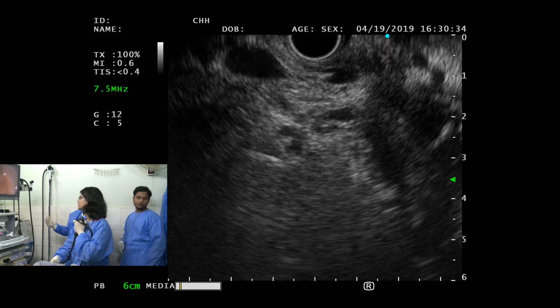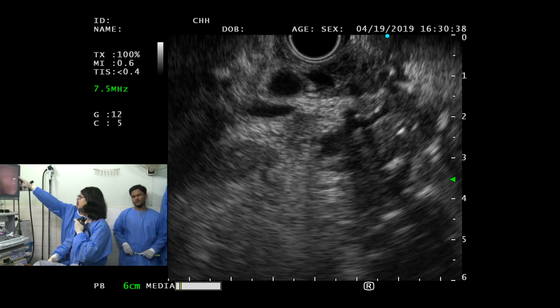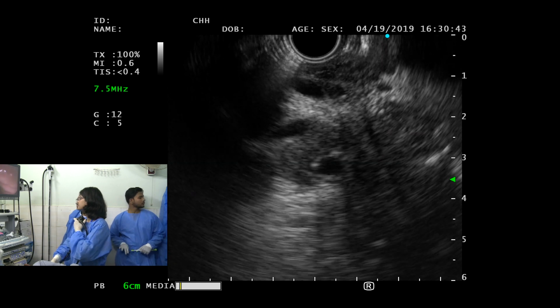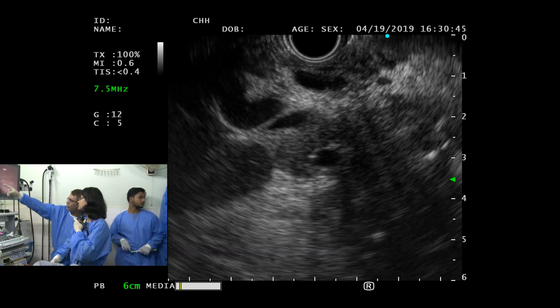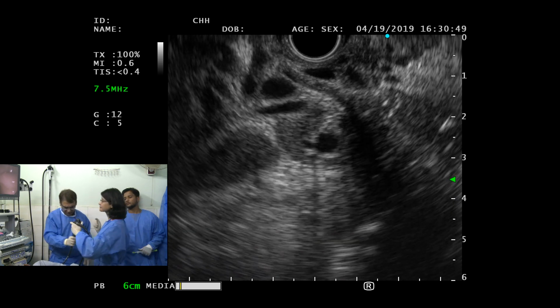Pull it back a little bit. Pull it back a little bit. No, pull it back a little bit. It's right here. So that's just a groove. Okay. Or maybe this is just a groove going here. One minute, show me. Okay, on both sides too.